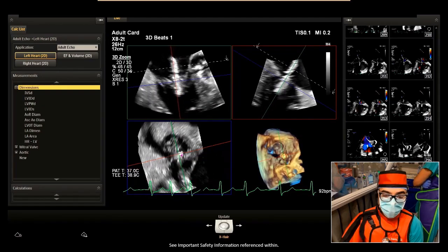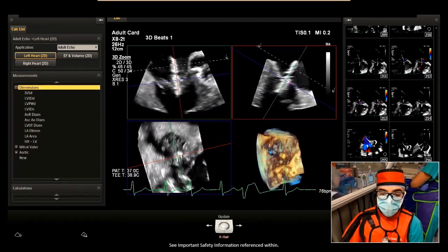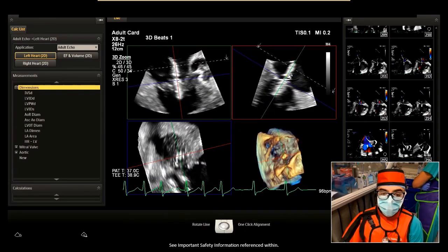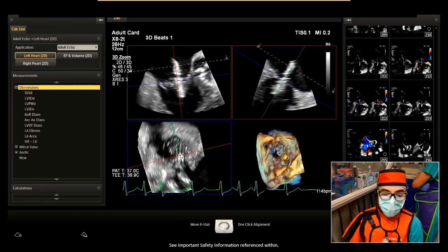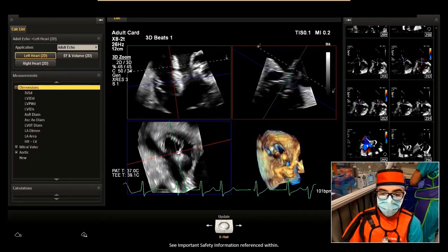My red plane is right over the clip arms here, so you can kind of see here. Here's the clip. This is your actual grasp view right here. This looks absolutely fantastic. If I want to assess this, you can grab this blue plane. You can move a little more cable while looking at the red plane. Come back.